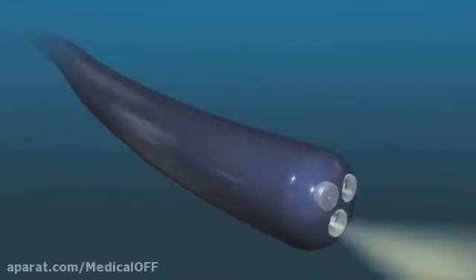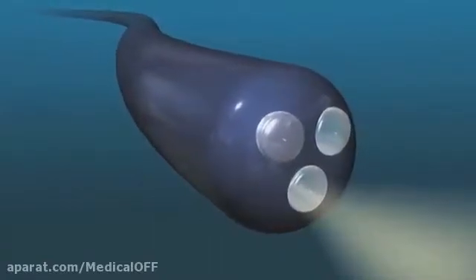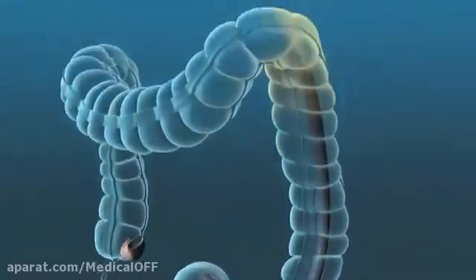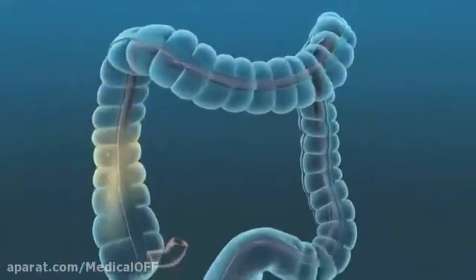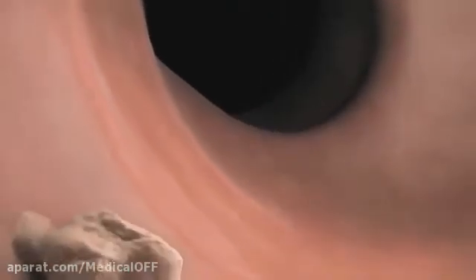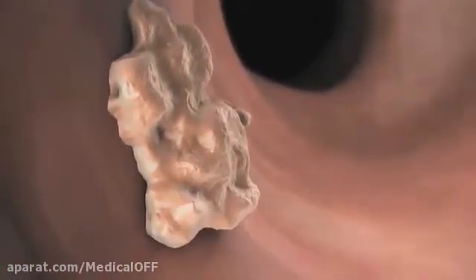During the procedure, your doctor will use a colonoscope, a long, flexible tube with a small camera and a light on its tip. Your doctor will insert the colonoscope and guide it through the entire length of your colon. As your doctor slowly removes the colonoscope, he or she will closely inspect the walls of your colon by viewing video images transmitted to a monitor from the camera.